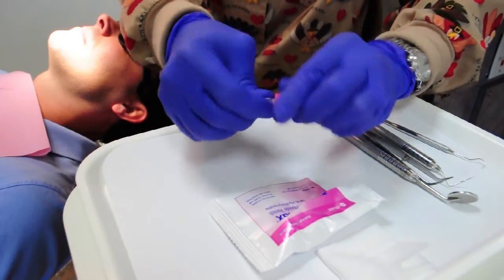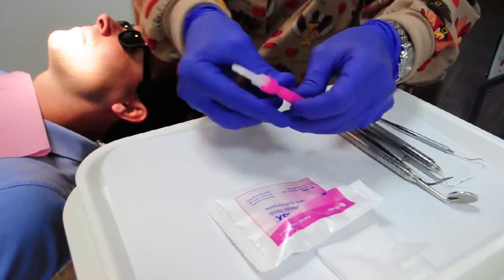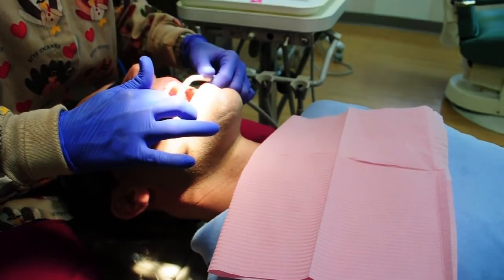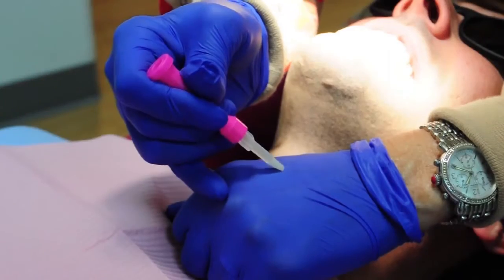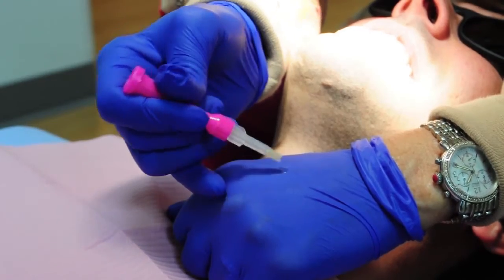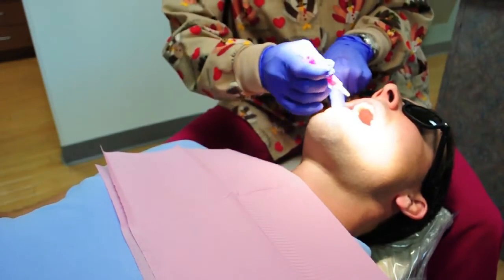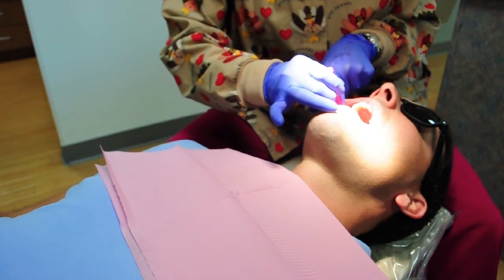Again, evacuate pooled saliva, but don't dry the teeth. Squeeze the ampule to moisten the brush. Do this over the gauze or the back of your glove until you get used to how much pressure is needed to wet the brush without dripping. Then 1 swipe across the buccal surfaces is all you want. Again, if you see white streaks, you've applied too much.